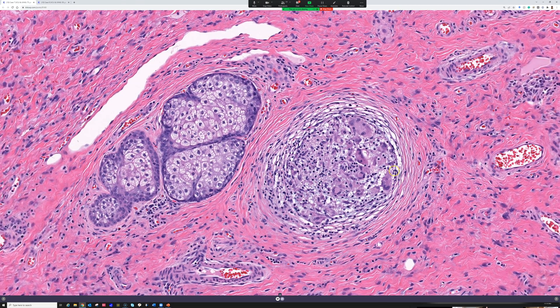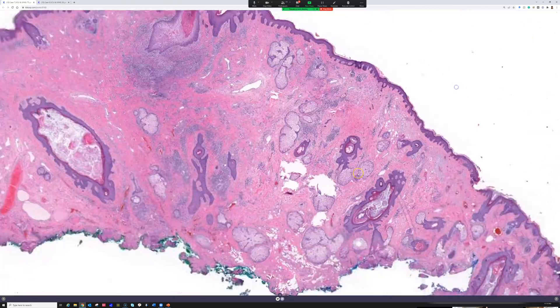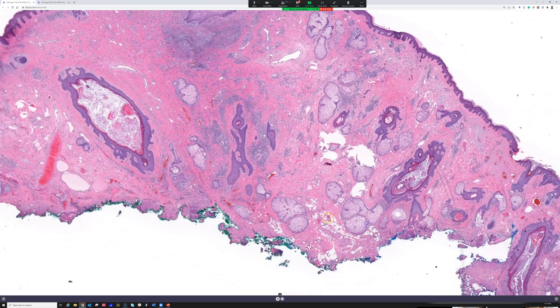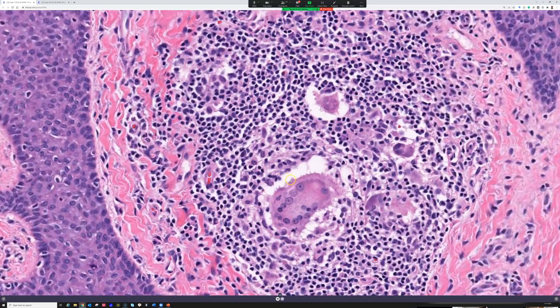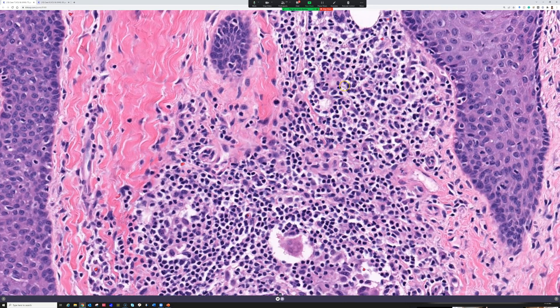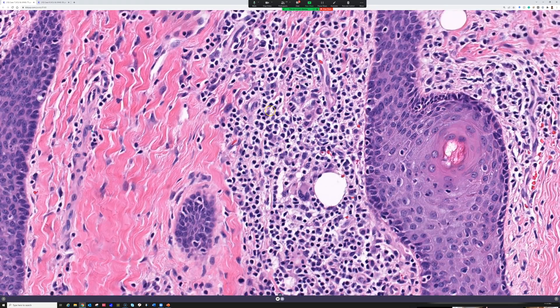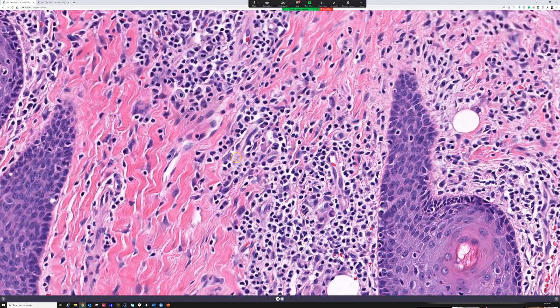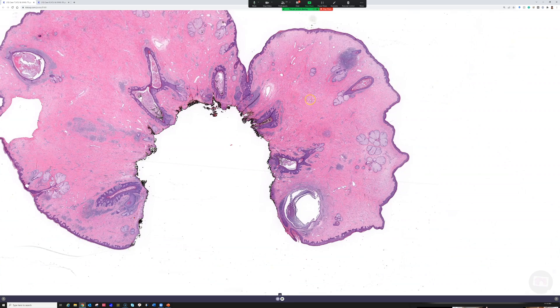We also have some early granulomas appearing, and in other views I was seeing plasma cells. There are some giant cells and some plasma cells — it's sometimes hard to get them to show up, but there are a few plasma cells scattered in there. Let me show you the next slide to give you some different views.